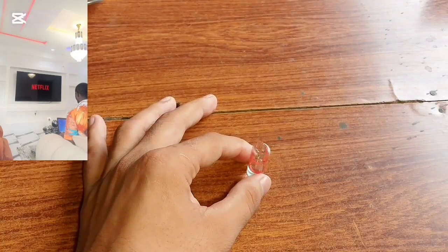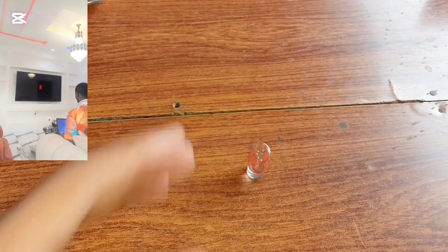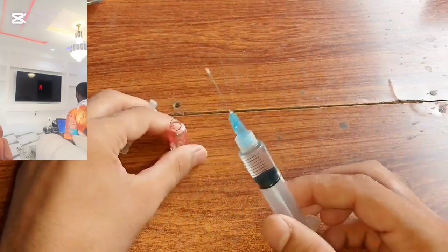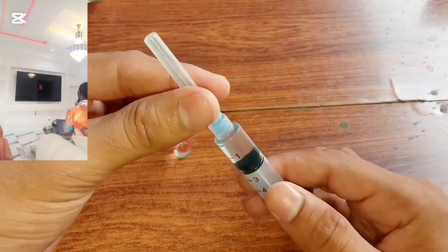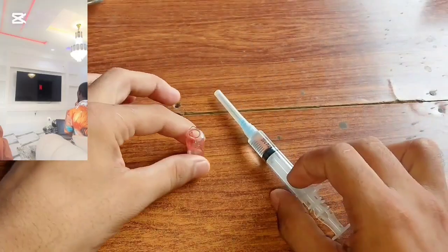You aspirate your medication, after which you quickly recap your needle. This is the recapping while you take it to the patient bedside.